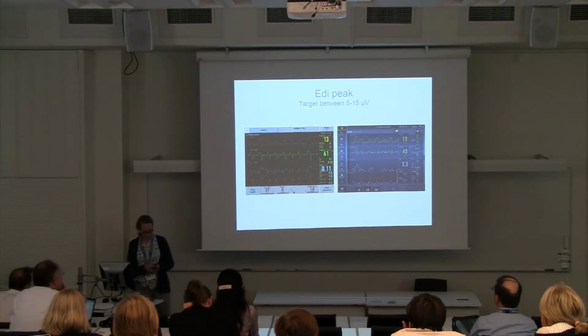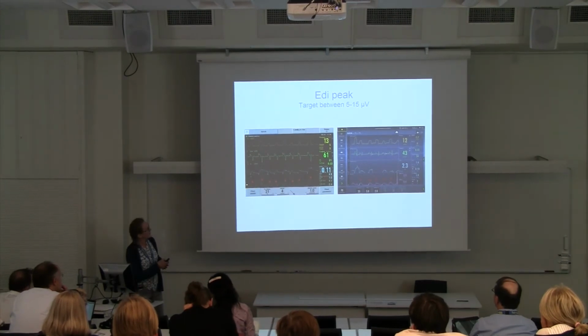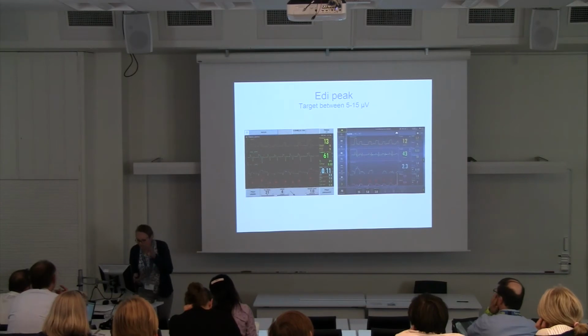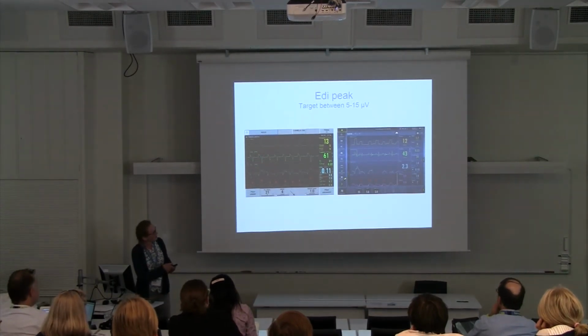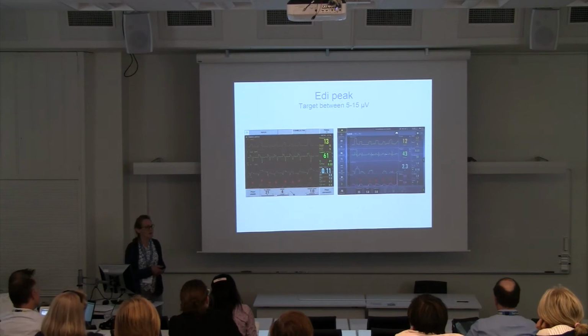So here we have these 2 infants on NAVA ventilation. The y-axis is from 0 to 20 here, and from 0 to 20 also here. And the EDI peak values are between 5 and 15, so we were quite pleased with the NAVA level here.